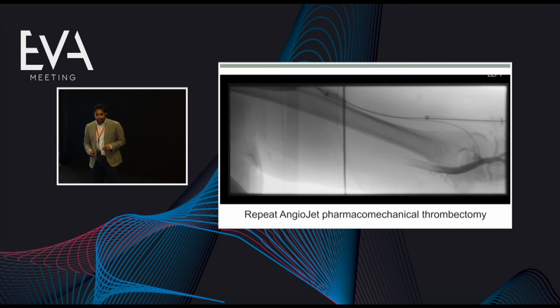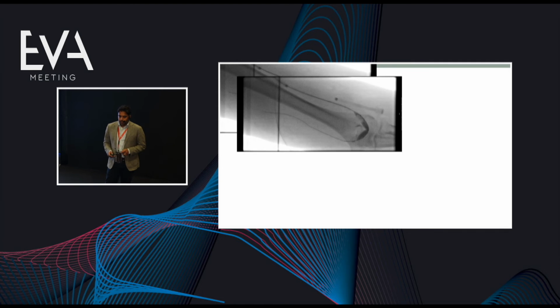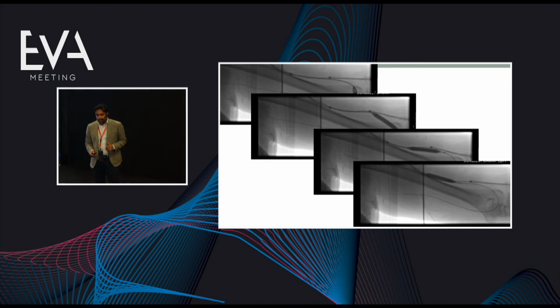Having done that, we established reverse access going into the proximal brachial artery and repeated the process with the thrombectomy. But having done that, and then following that with a balloon trawl and angioplasty of that anastomosis and complete balloon trawl, I just could not establish flow into the fistula vein and clear the needling segment. So we did a repeat balloon trawl angioplasty, and having done that, we were able to establish flow going into the anastomosis and that first segment of fistula vein, but the thrombus in that needling segment was just very resistant and would not shift.